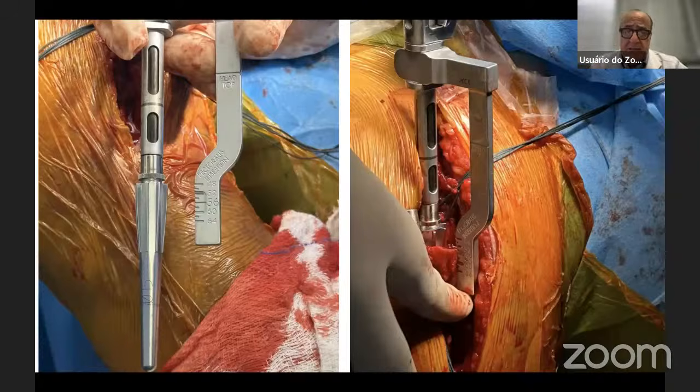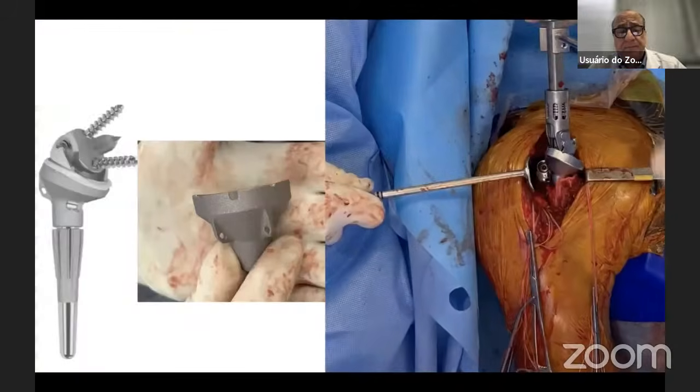It's a press fit stem that I think is good for this fracture scenario because you don't use cement. I think the cement, mainly in the upper part of the fracture related to the tuberosity, is something that can make the healing of the tuberosities much more difficult.